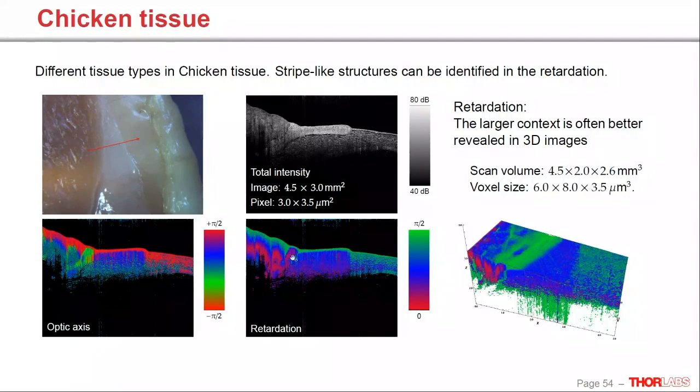And if we take a look at a volume scan, we can also see that on the membrane here, we have some stripes that are oriented in this way. And the region that I indicated, that I show here, has also some stripes, but they are oriented just 90 degrees to those in this region.